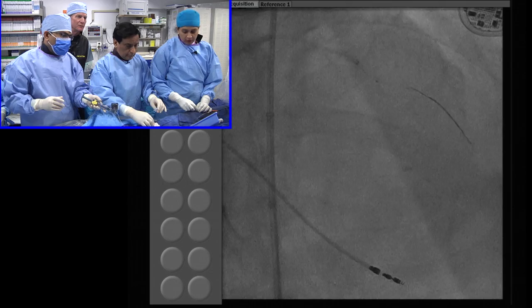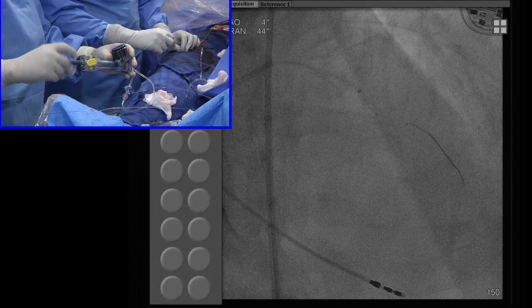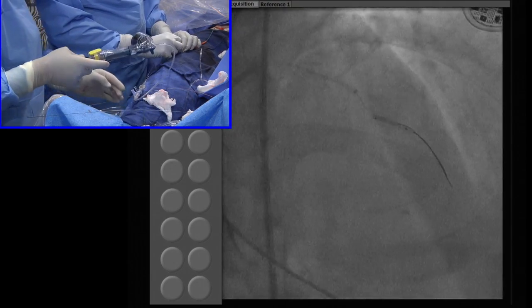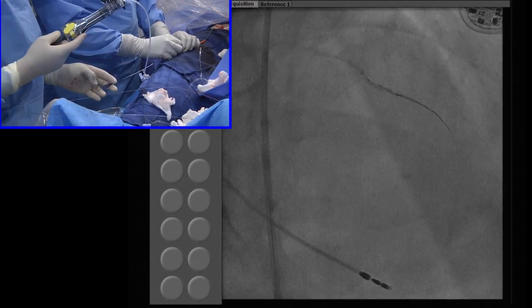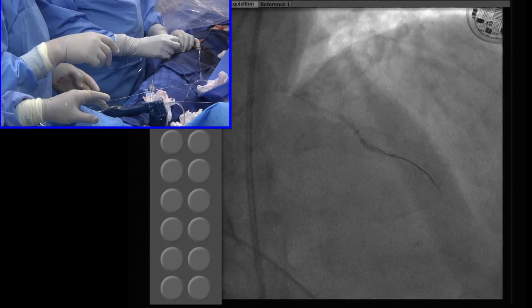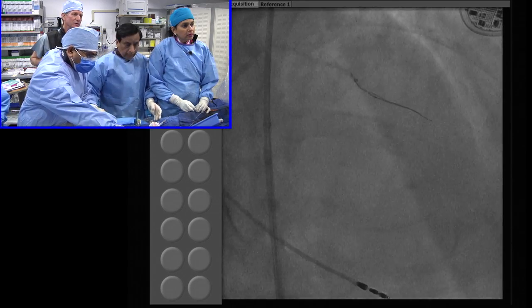Right. So the future data that will be coming out from Absorb 4, pooled with Absorb 3, is intended to show superiority of Absorb over Xience at 5 years of follow-up, because that's when the scaffold's completely resorbed, and that's when we would expect the outcomes. For the overall cohort or even for subsets? For the overall cohort. Excellent. Deep breath, sir. So, it's possible if we show superiority at 5 years on long-term outcomes, that then we could go back and apply for a differential DRG or reimbursement.